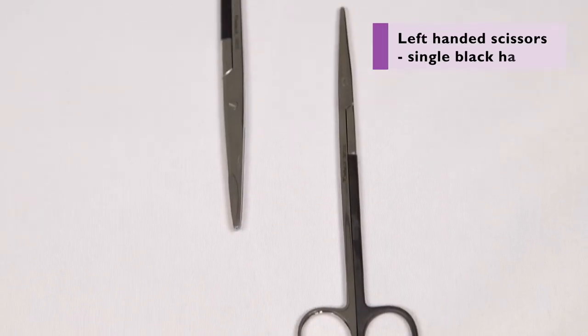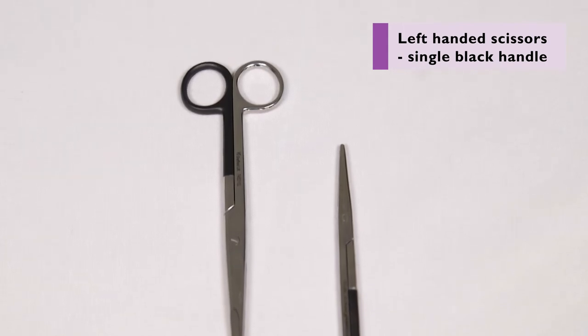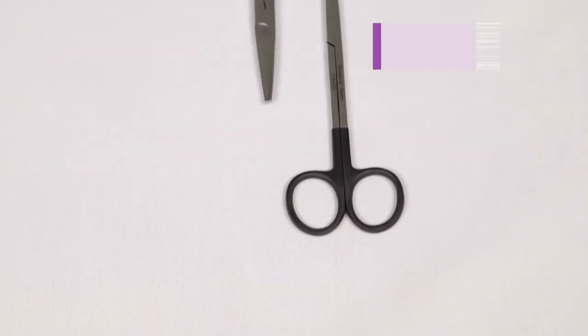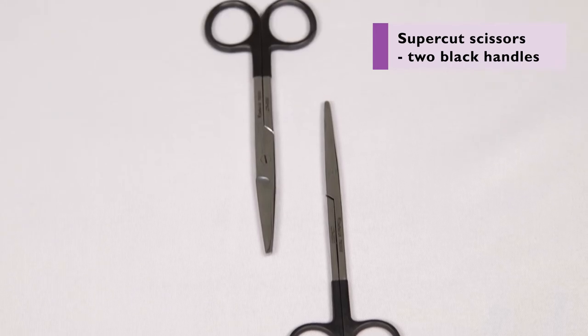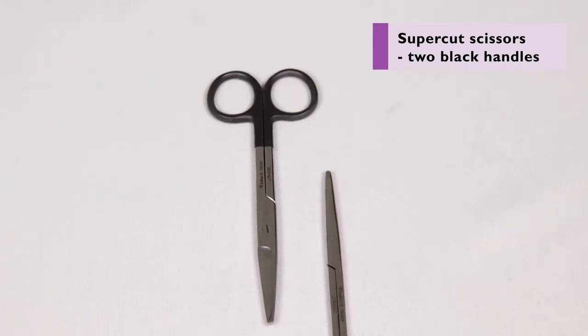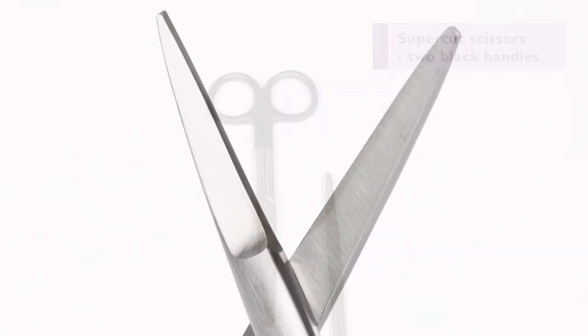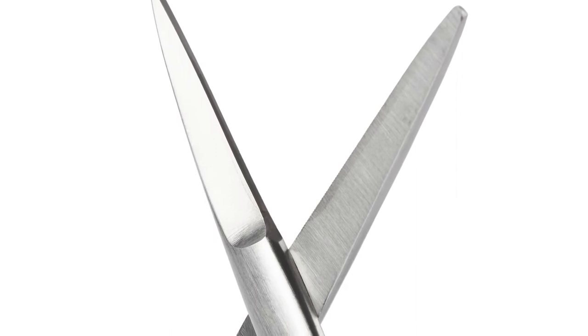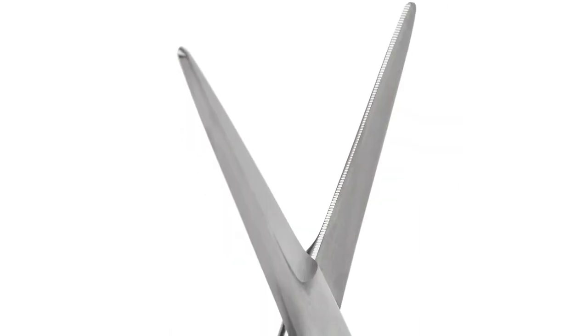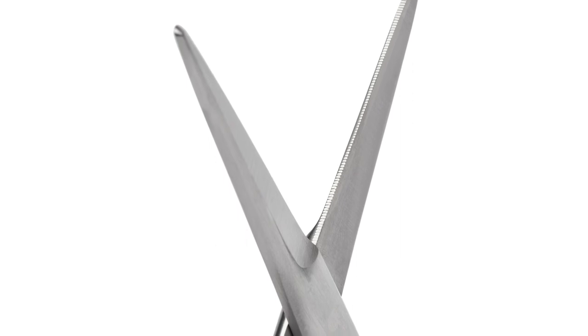Instruments made specifically for left-handed surgeons have a single black handle. Two black handles indicate supercut blades. Designed to enhance the cutting performance, these scissors have a highly sharpened upper blade combined with a lower blade that has micro serrations along the edge.